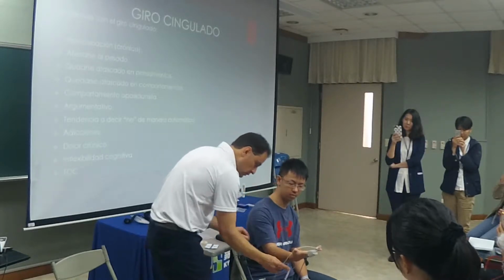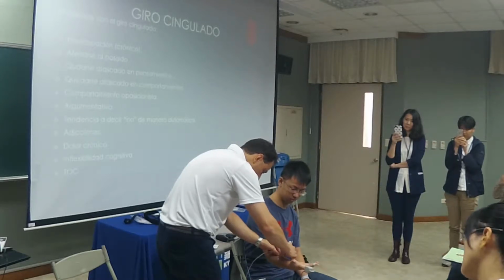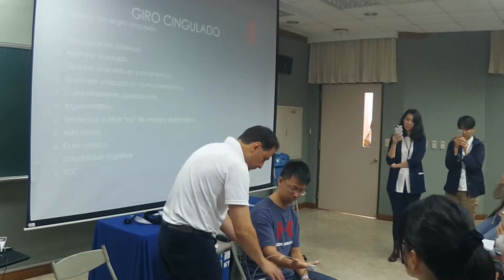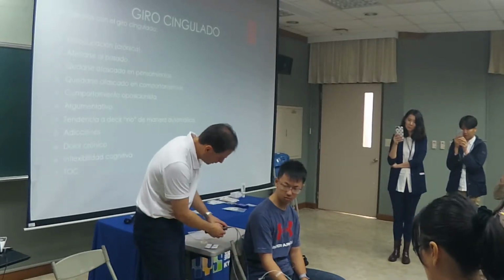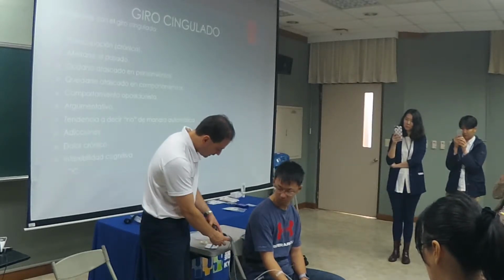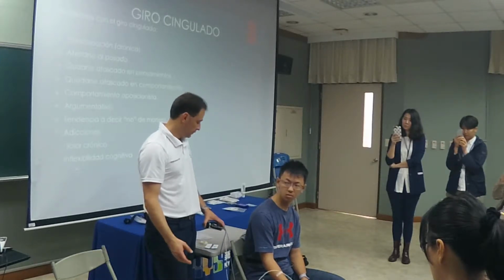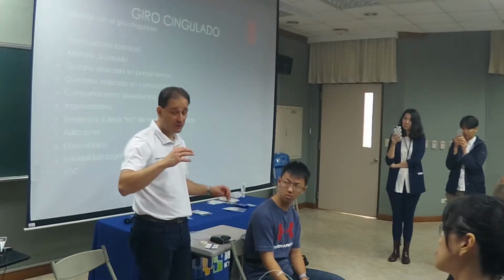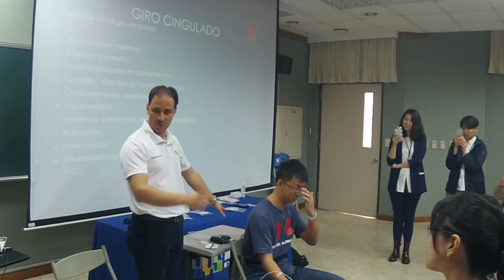So I'll just tape it here, and that's going to minimize movement. And we're going to put your hand back. You have to make sure that when they extend their arm, they're going to pull on the cable, because if they pull on the cable, they're going to bring the amplifier down with you. Okay? And with hyperactive kids, you have to be extremely careful because they're going to want to get up really quickly and they're going to take everything home with them.